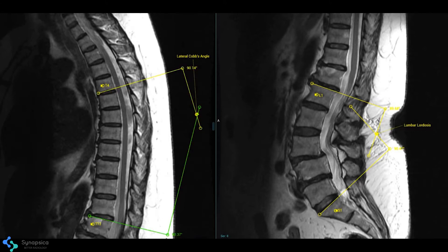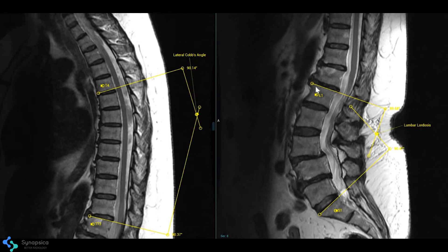It assesses spinal alignment deformity with Cobb's angle analysis, anterior or posterior listhesis, etc.